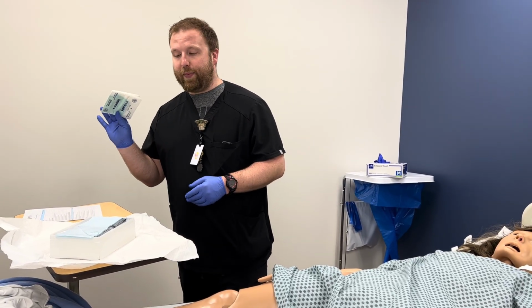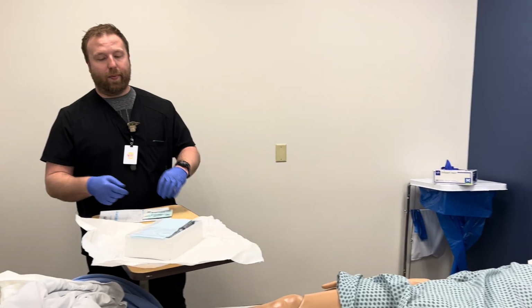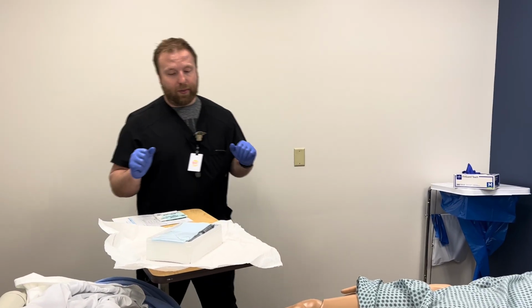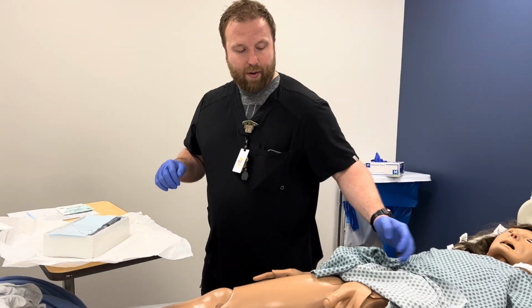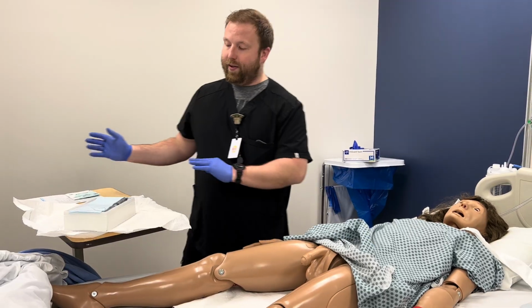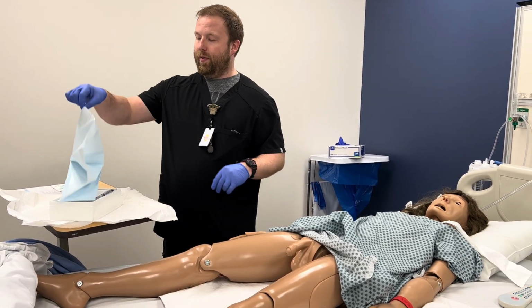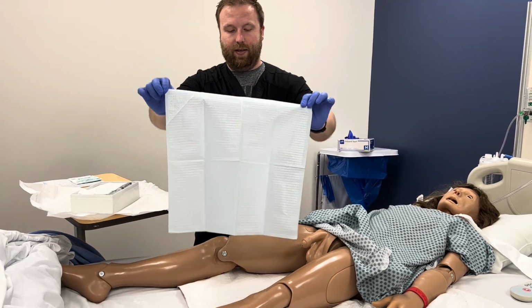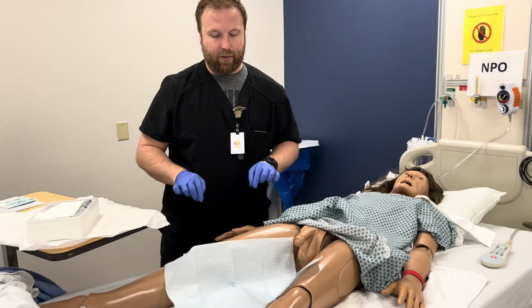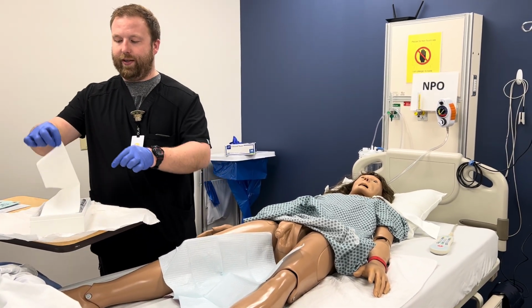Sterile gloves will be on the top here. I would come down here, remembering I'm not going to open my sterile gloves over my kit. I would place my sterile gloves. Those don't fit me. I'm not going to put those on. But prior, you want to make sure that you expose it. I'm going to put on my sterile gloves. I want to get this, and you can lay this between the legs there. You'll have another one in here.